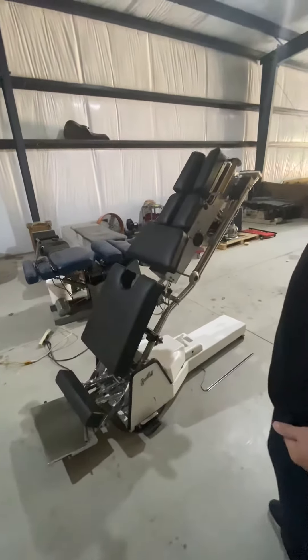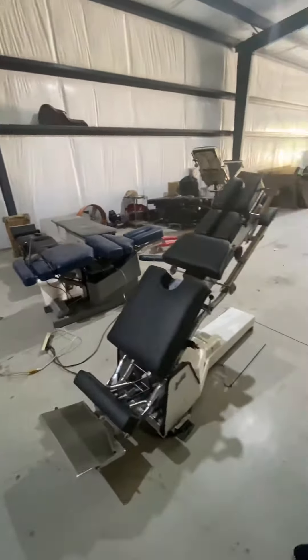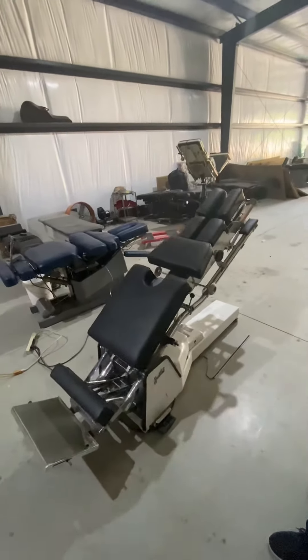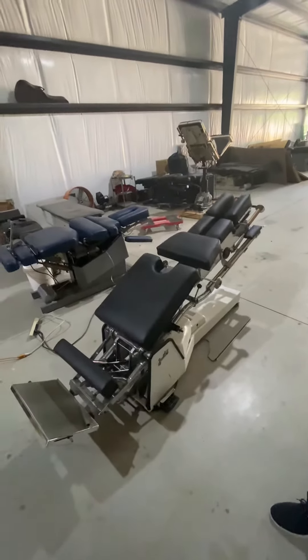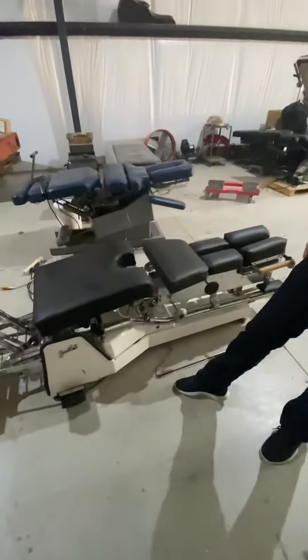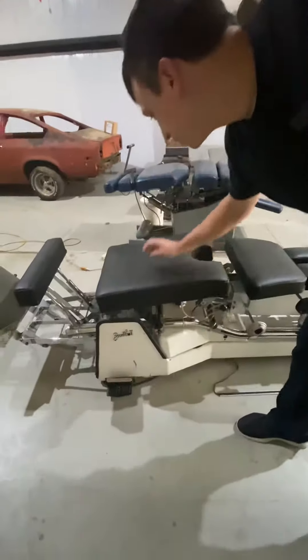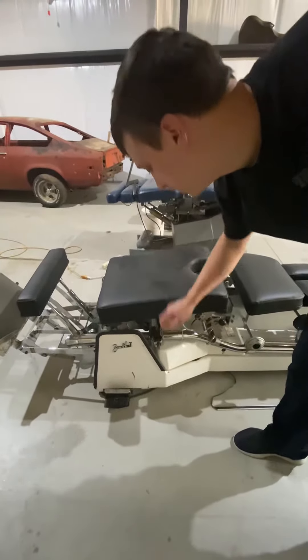We have the table powered off — a Hill Table sitting next to it. You would need the external compressor to technically run it in a clinic, but everything's working. We're using that to show you the new tape switches. The raised pelvic knob is missing on this side; the other side does have it. I would move it over to this side depending on which side you adjust from.